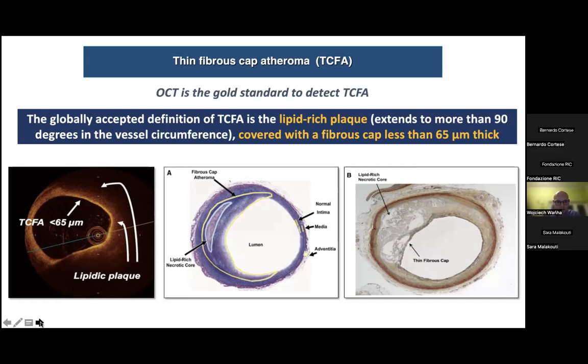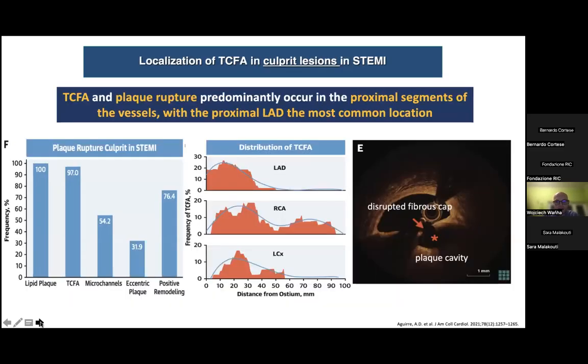All right. So can I go? Yeah, please. There have been many studies which assess TCFA in coronary artery disease. However, right now I will show you the study which I'm presenting: the localization of TCFA in the culprit lesion in patients with STEMI.